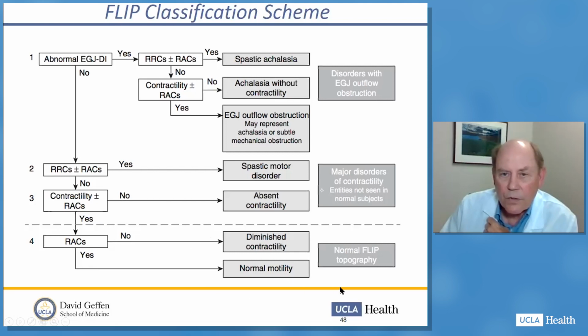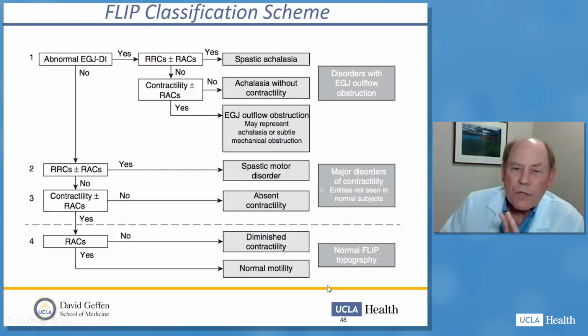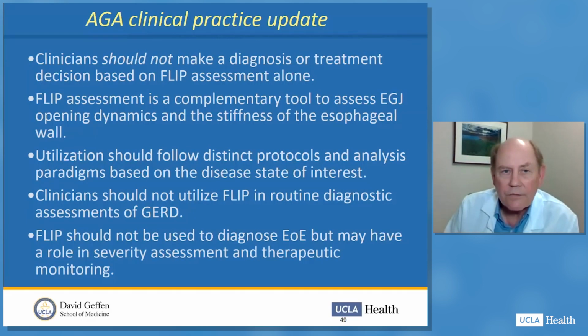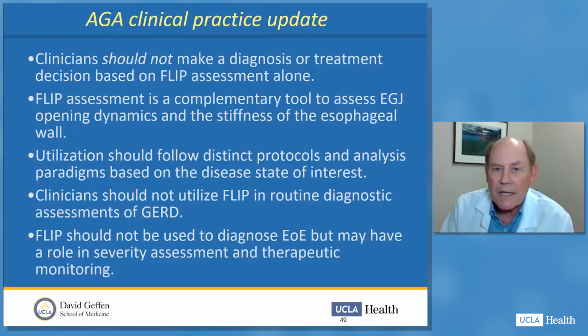So this is normal. I'm sure that this is going to be adjusted and modified over time as people understand more and more about this technology and the way the esophagus responds to the technology. So finally, there are some AGA clinical practice guidelines. The AGA says that clinicians should not make a diagnosis or treatment decision based on FLIP assessment alone.